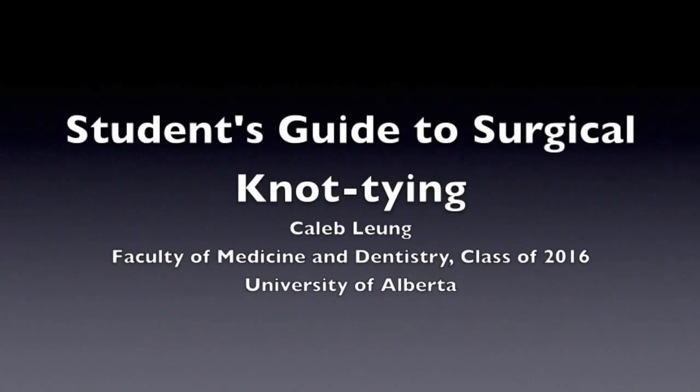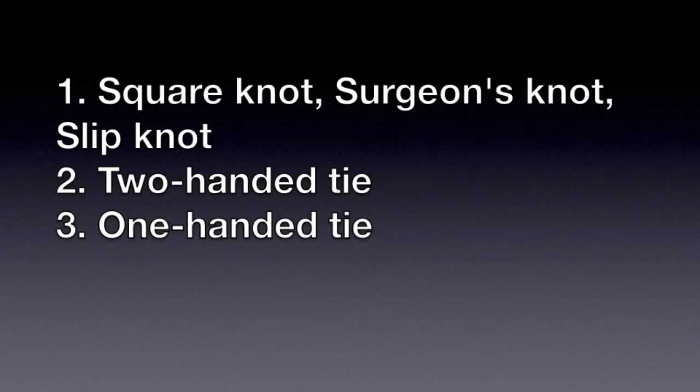Hi, my name is Caleb Leung and this is my student's guide to surgical knot tying. We're going to cover a few concepts: basically the square knot, the surgeon's knot, a slip knot, and how to make these knots using a two-handed tie or a one-handed tie.